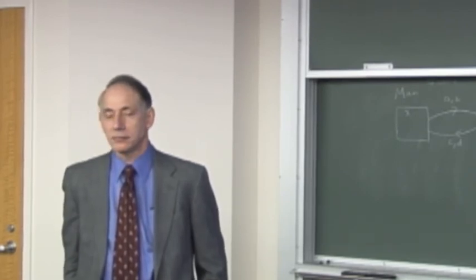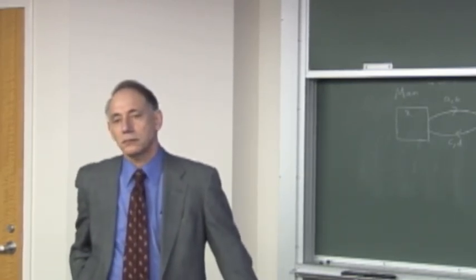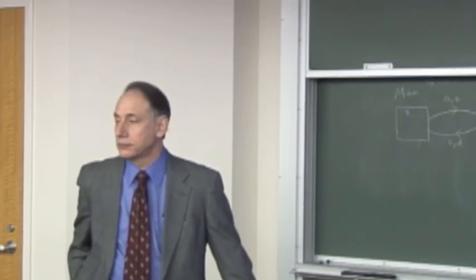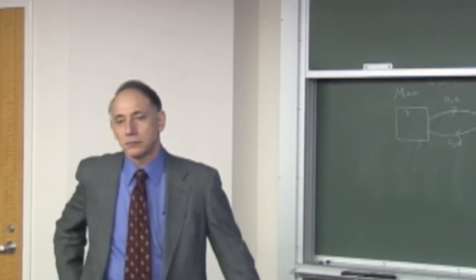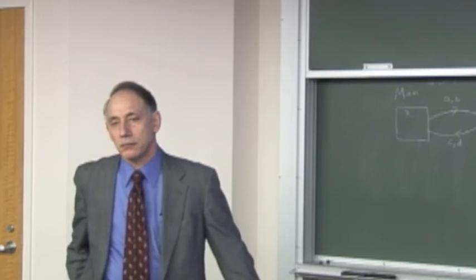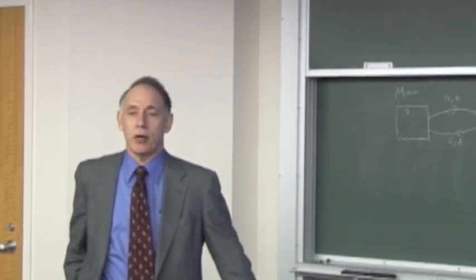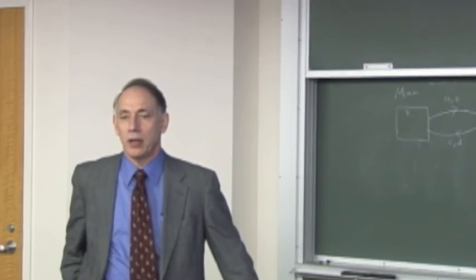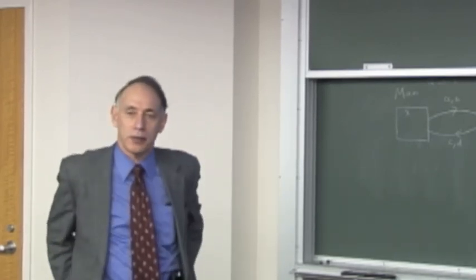Ben Barsline and I were talking about this, and he said it's not actually offered anymore. It's not even available. Because it's part of the Japanese criteria, I think they're probably more forward on diagnostic criteria for cardiac sarcoidosis than we are. Well, there are these published Japan criteria which don't include this kind of imaging. Correct. And I think MR imaging is going to take over for sarcoid, because it really seems to find the actual areas that are affected with much better resolution than the gallium would.